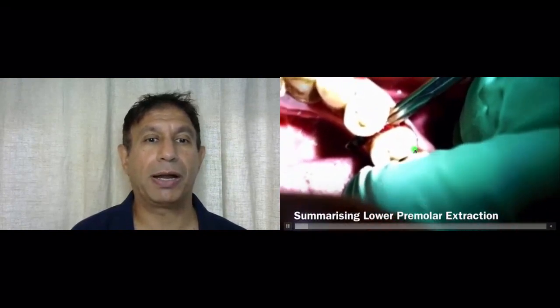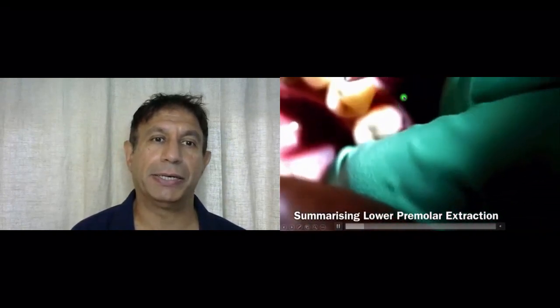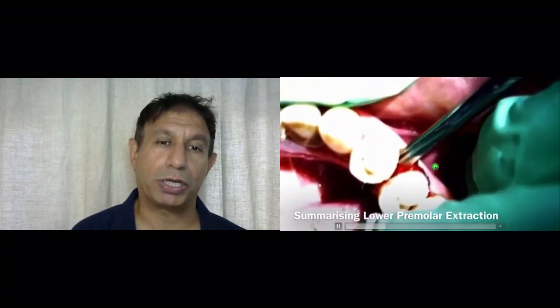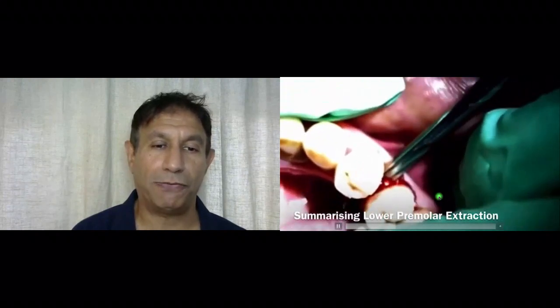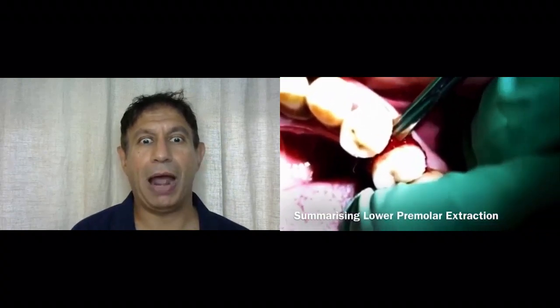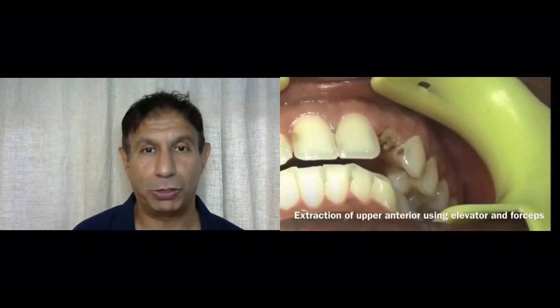So when we see that done in real life, we are putting our elevator here and the elevator is going in the front part of the tooth, concave side faces the tooth, turn it by a quarter turn, pushing the hard tooth against the soft bone, expanding the socket around the tooth. So it's loosening the tooth up. And once you loosen the tooth up, remember the elevator is in constant contact with the tooth. It is not jammed between the two teeth. It is jammed between the tooth and the bone, with the elevator in constant contact with the tooth. And then you hold your forceps and you move your forceps, grip it as low down as possible, outside inside rotary movement, and out pops the tooth.